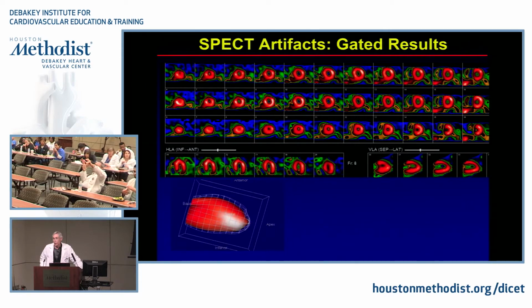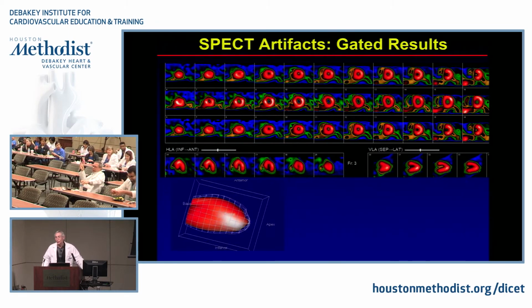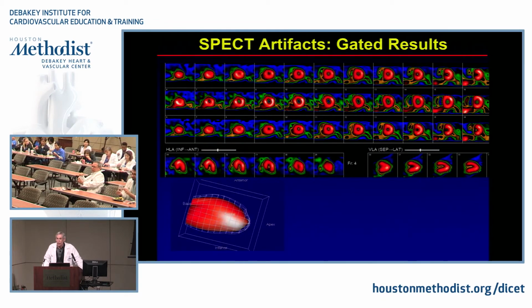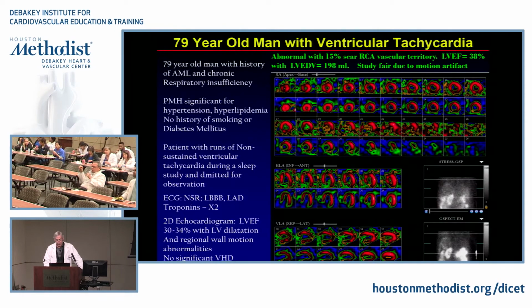Well, yeah, the patient has to. Which means you depend on very astute, good technicians that will pick this up. Well, I don't know if it's very astute. I would say that if someone sees a defect on the first study, they should flip them over and put them prone and see if the defect goes away. I would be willing to bet a bottle of wine that this doesn't happen in most places on the street. Well, again, it's a matter of education and such.